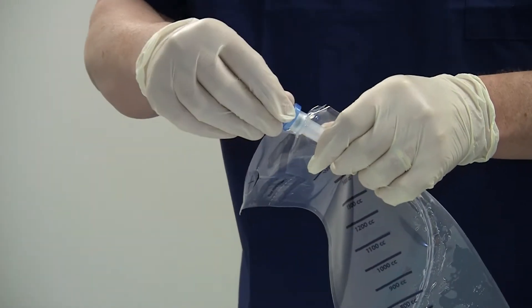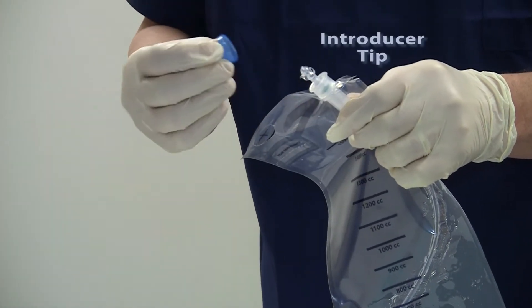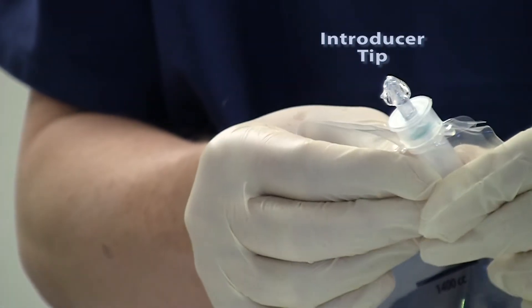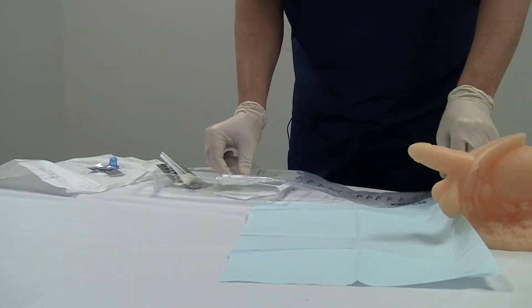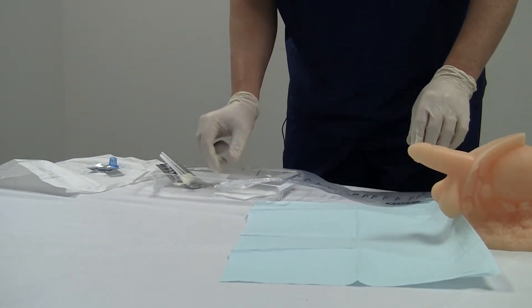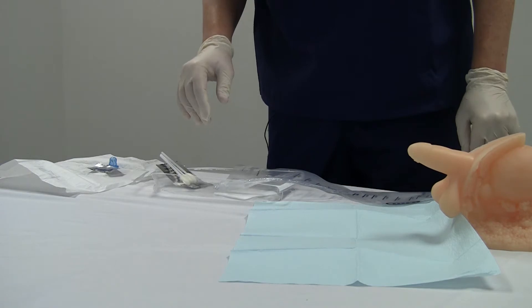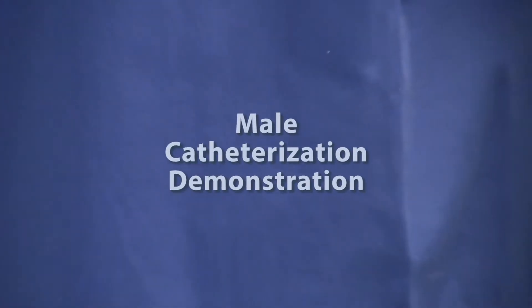Now, I'm going to remove the cap and expose the introducer tip. I'm just going to discard the cap and place the closed system catheter back in my sterile field with the introducer tip inside the tray so that it remains sterile. So now we're ready to go to the patient.